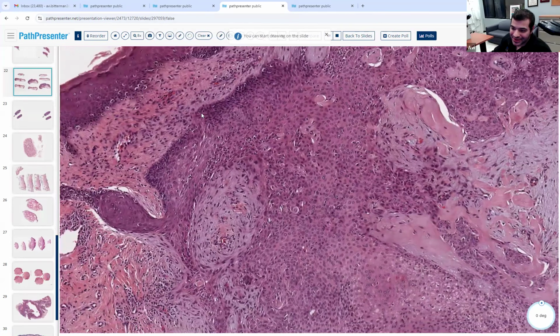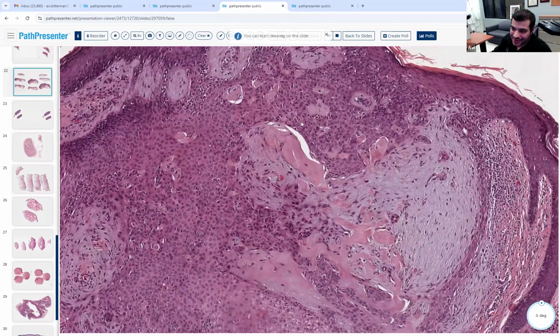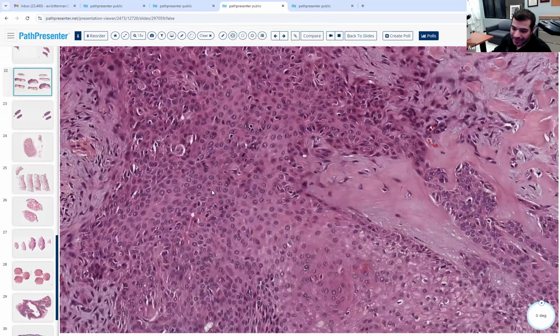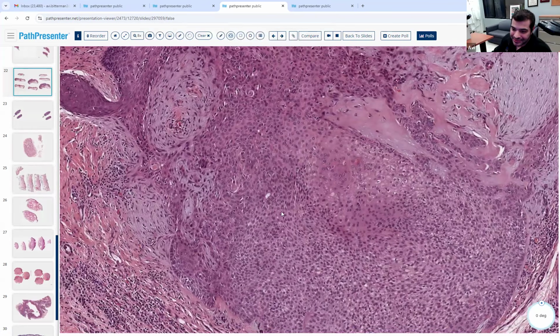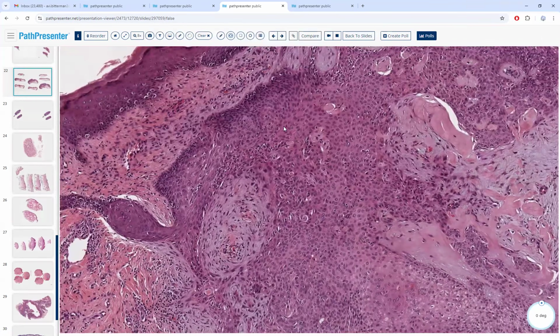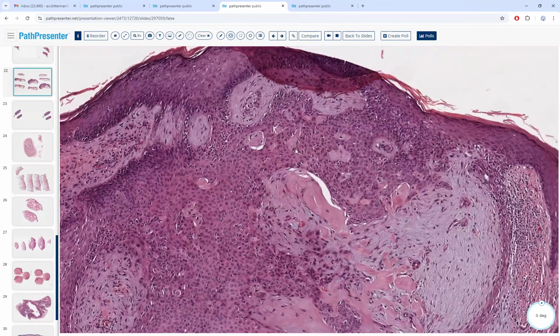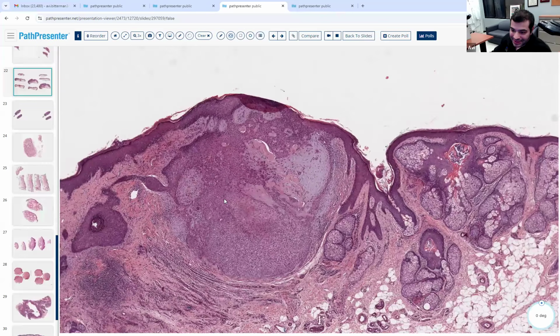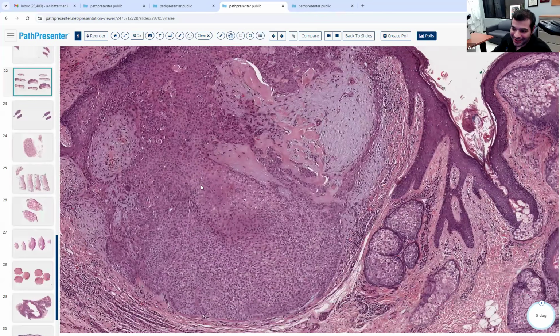what about atypia? Do you see any frank atypia, mitosis, pleomorphism? Any nuclei that are awfully hyperchromatic? I guess not. Okay. So why did it look so ugly?